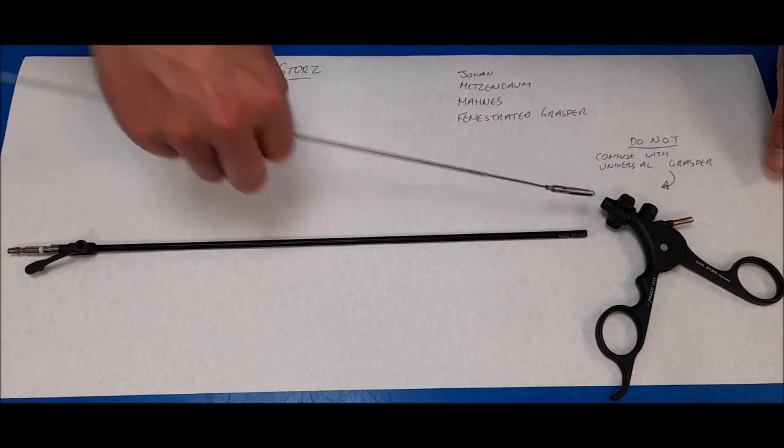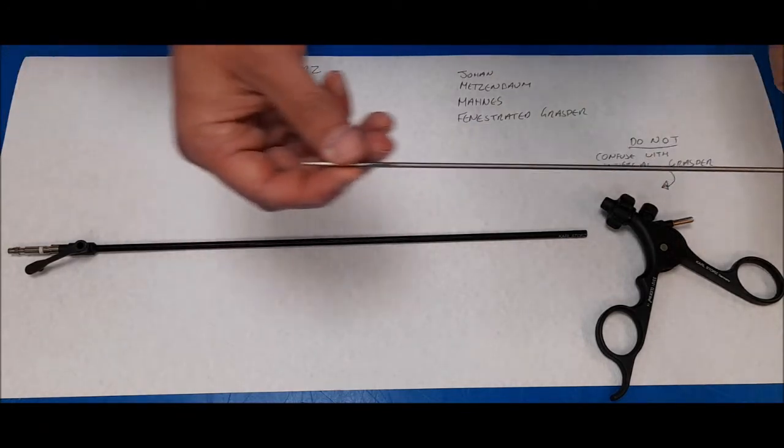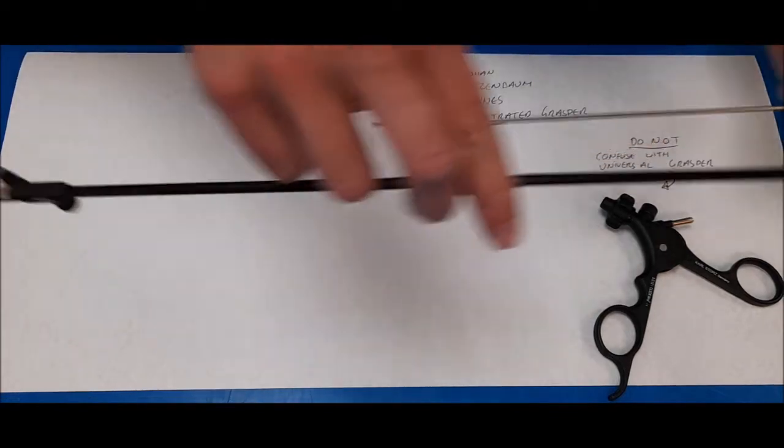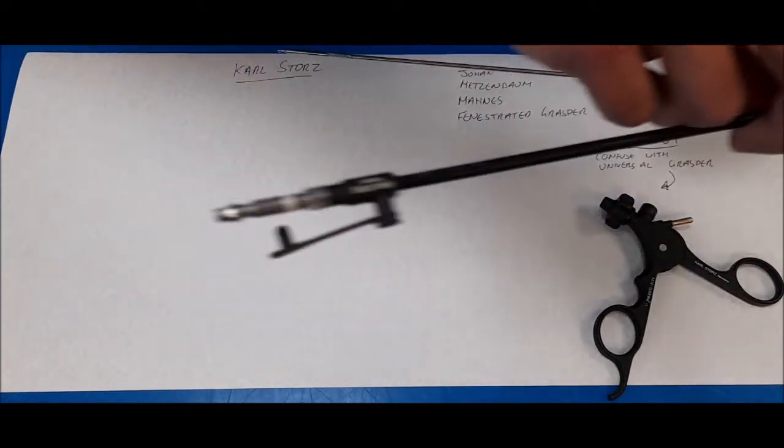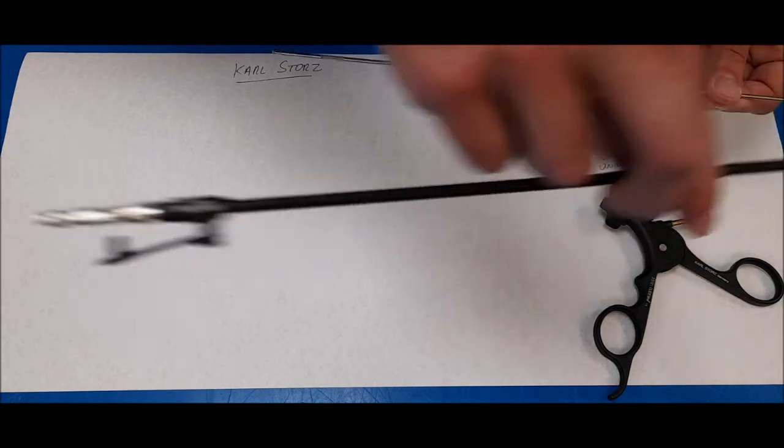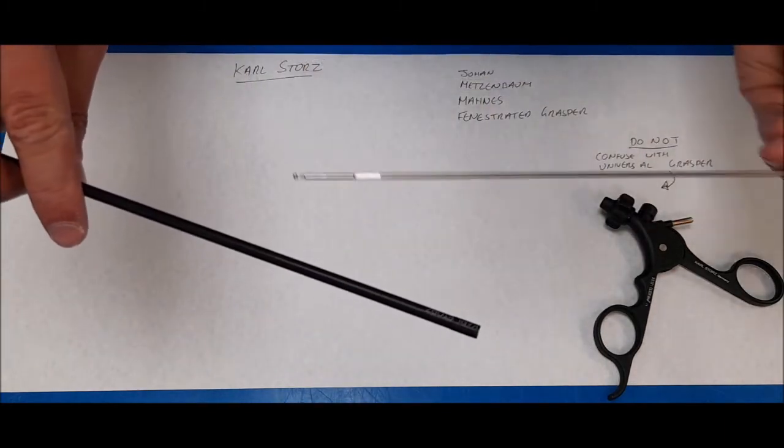To begin with, you will pick up the insert and the black sheath. This end is the connection end to the handle, and this end is what slides over the insert.